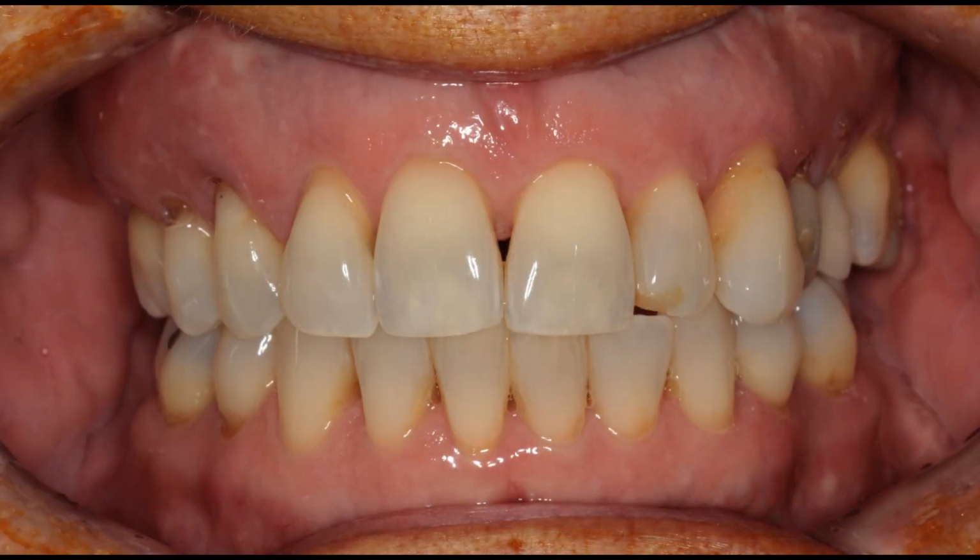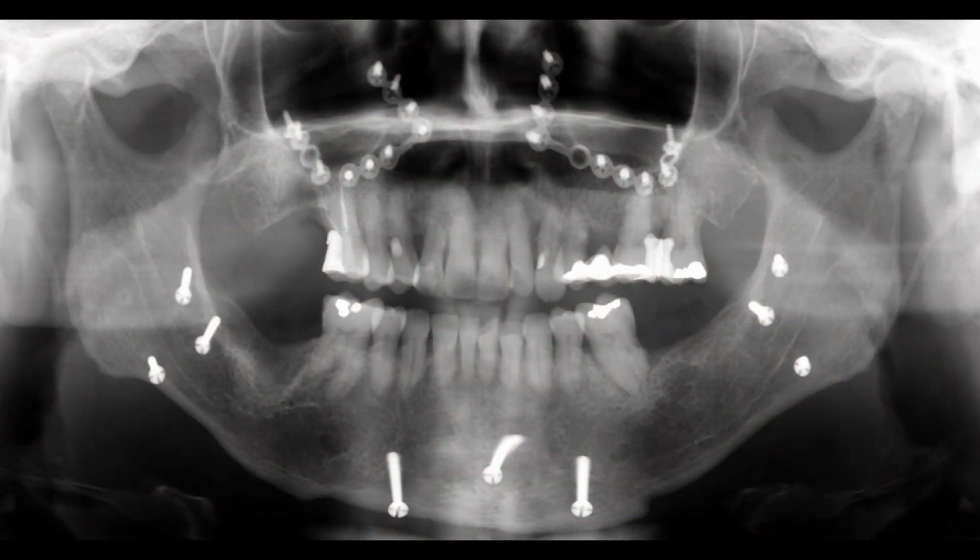Here's a former hygienist from Pennsylvania, actually, my home state. Her teeth look great, so you might wonder why she's here talking to me about upper full arch implant treatment. Turns out that she genetically has very bad periodontal disease, and she's lost quite a bit of bone around some of the front teeth and a couple of the premolars. And so at 70 years old, she's ready to do something now rather than wait.